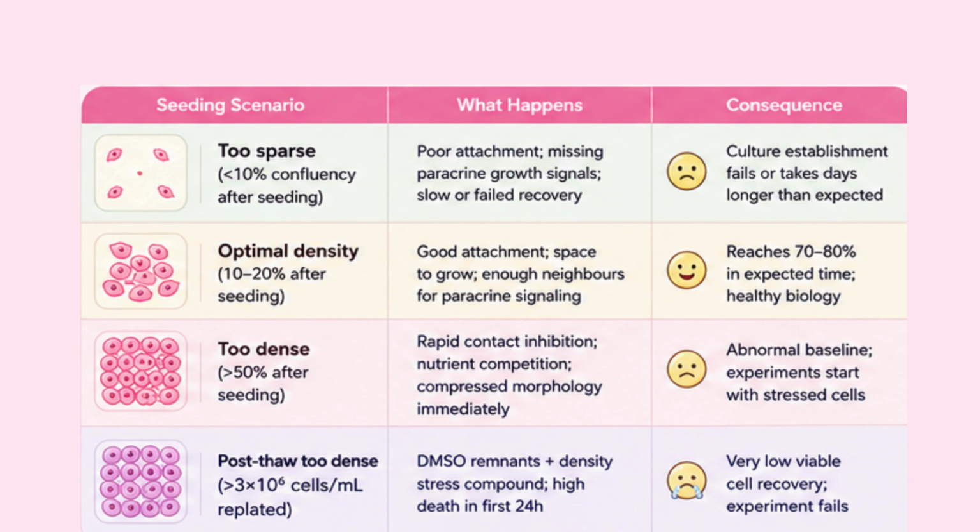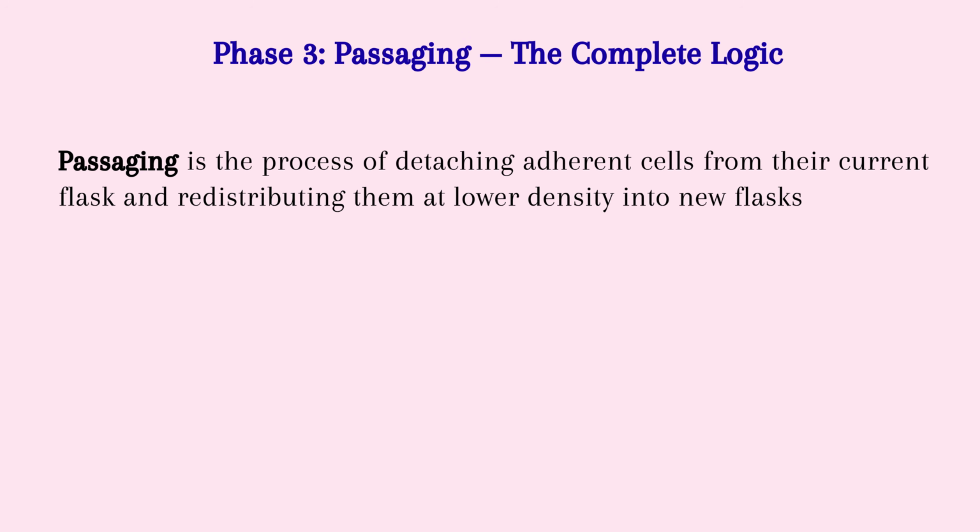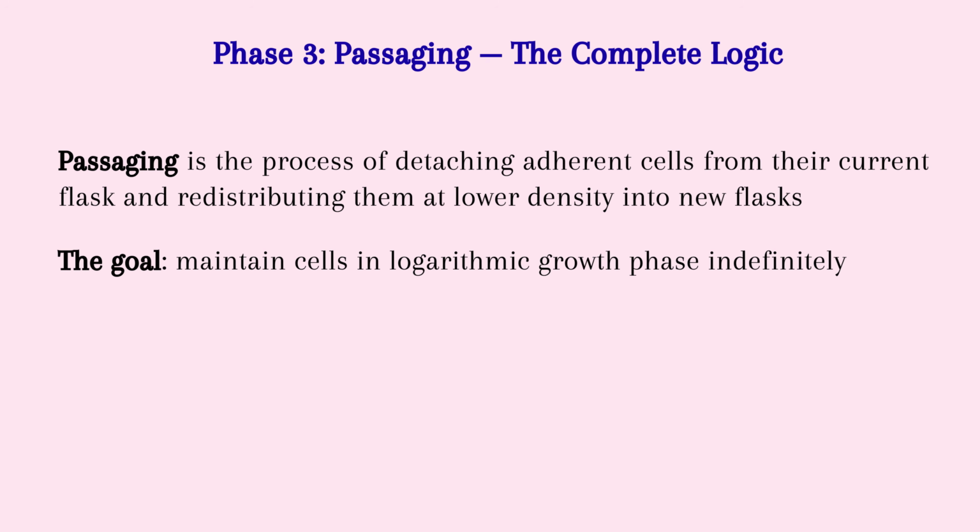The correct answer is B. As we learned in episode 6, DMSO protects cells during freezing, but once the cells are thawed and warmed, it quickly becomes toxic. As metabolism resumes, DMSO starts damaging the cells, and every minute they remain in warm DMSO reduces their survival. That's why the correct workflow is simple.